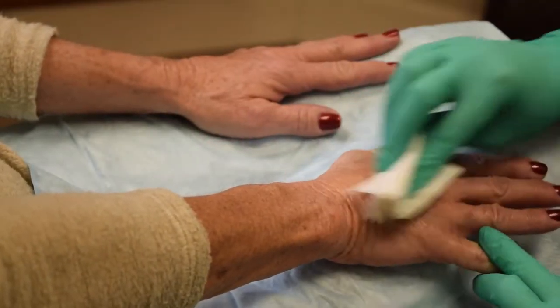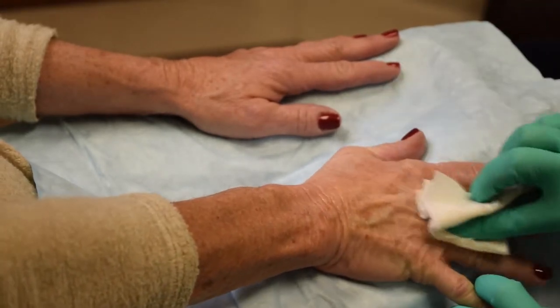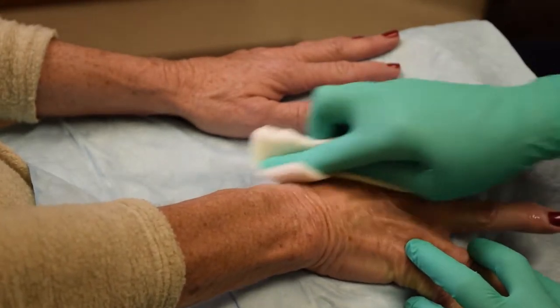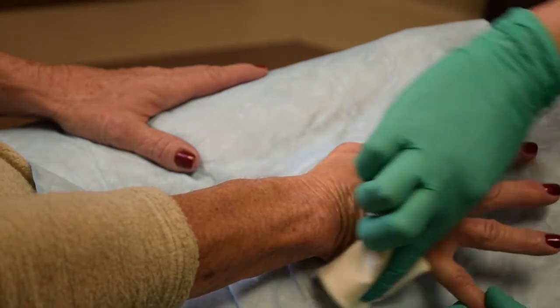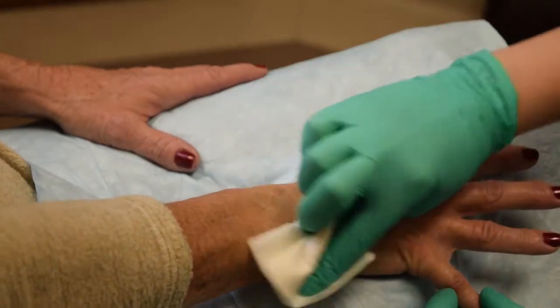Correction of hand volume loss with calcium hydroxyapatite offers instant gratification of a more youthful appearance, both to myself and to my patients. Needle and blunt cannula techniques will be demonstrated today.